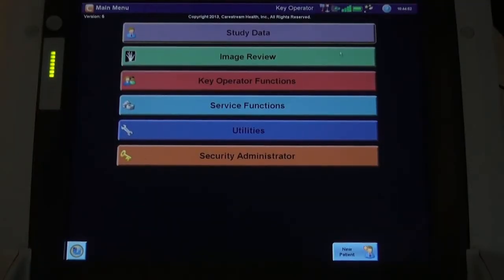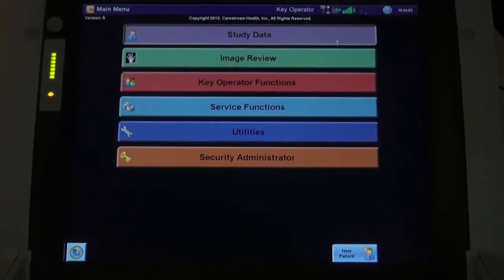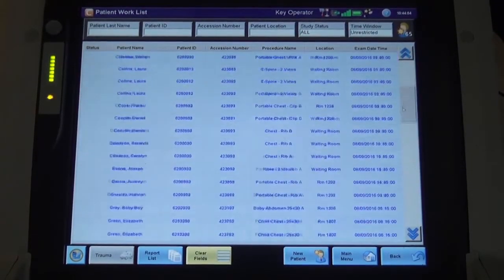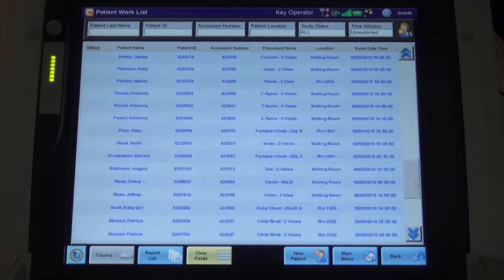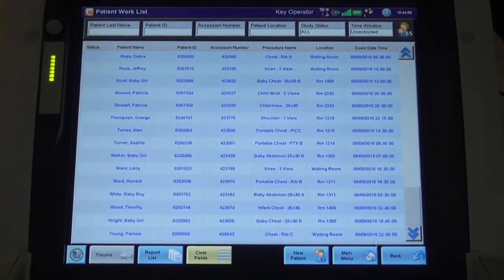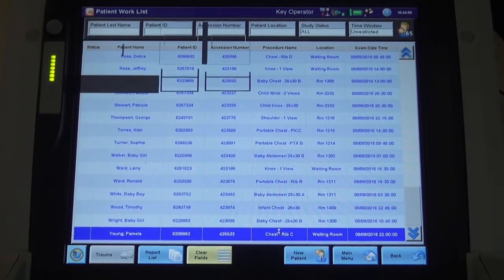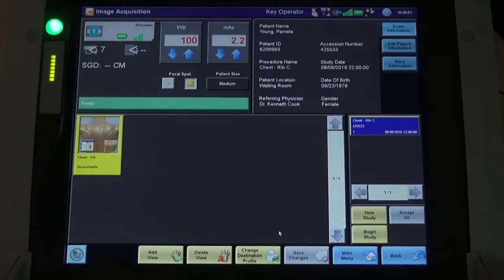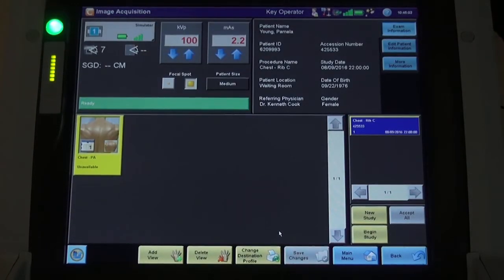Here is an example of bone suppression image processing on the CareStream DirectView software. We begin by selecting the patient from the modality work list. After verifying the proper exposure factors, the radiographer captures the image.